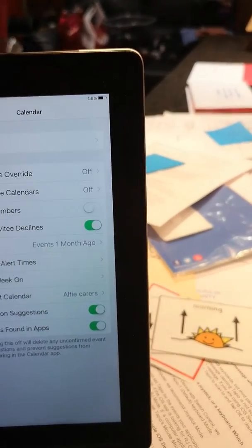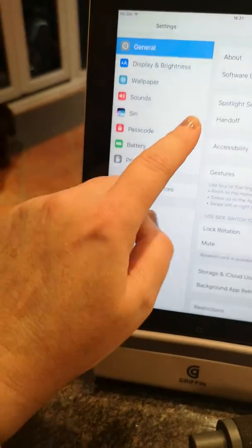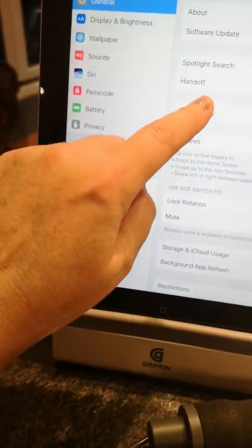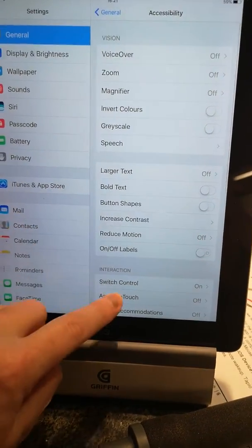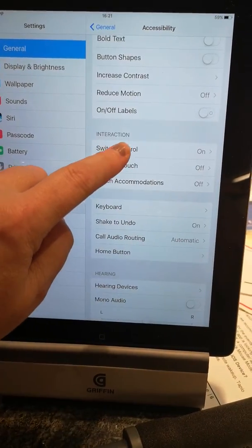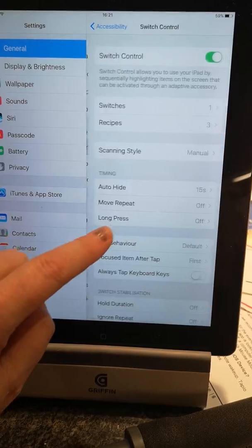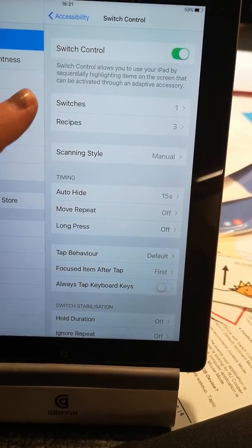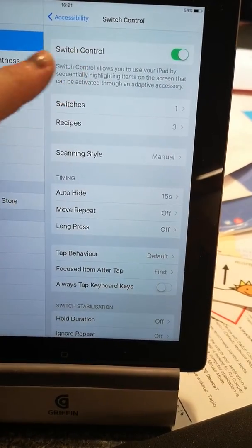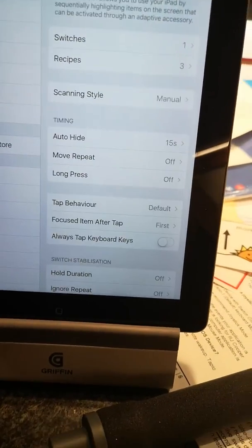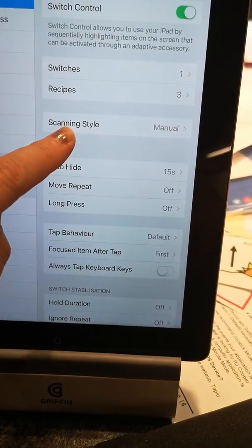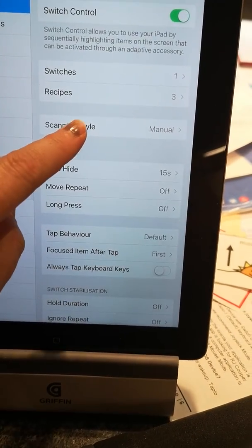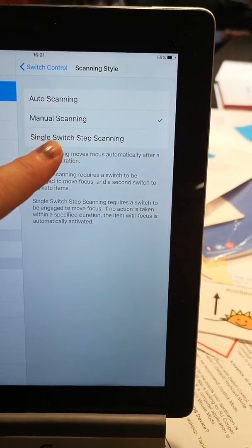General. Accessibility. Switch control is on, but on manual. So scanning style, I went into there and chose manual.